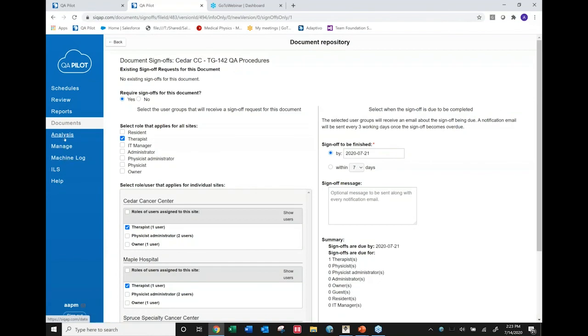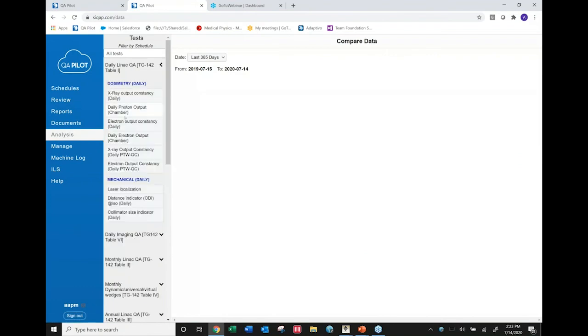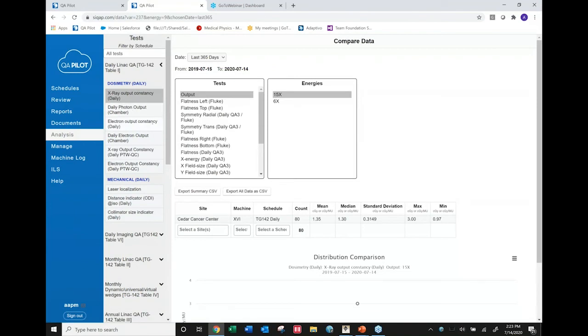Another thing that's really good for understanding what's going on, especially if you're a group: for any group of tests or individual tests that are performed with the same name and same frequency, across Linacs or across Linacs at different centers, at a particular output or energy, you're going to get the mean, median, standard deviation, minimum, and maximum values. That would let you know, okay, within our group, it looks like all our TrueBeams seem to be functioning very well. Or we've got one that looks like maybe it's not functioning, or you have suspicions about what's going on with your machine. You can even compare it to others and go, yeah, I'm not within the same range, and it allows you to investigate a little bit further.